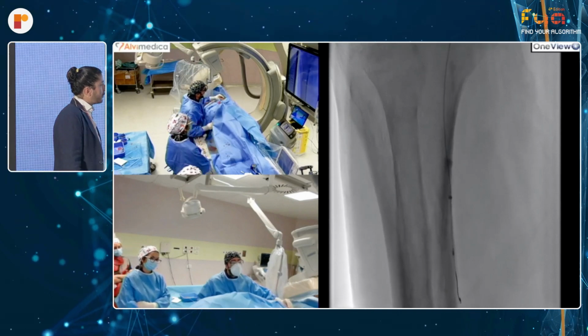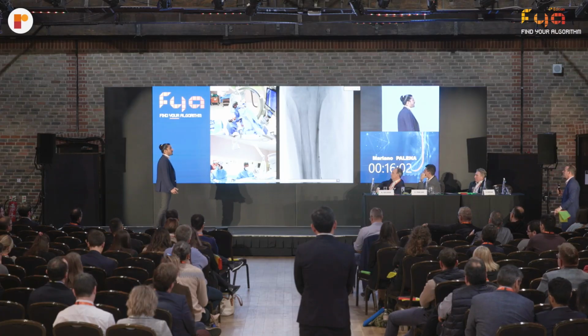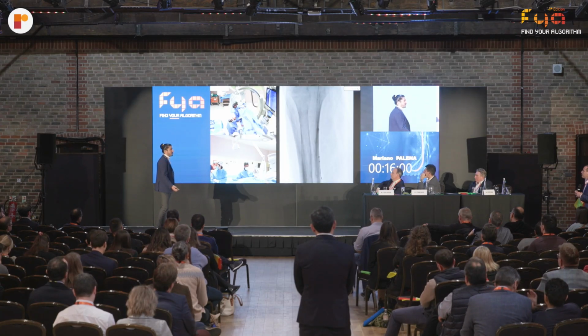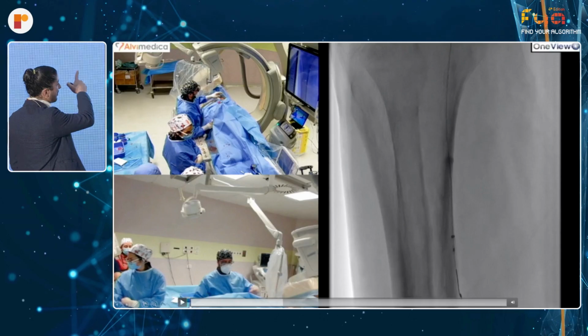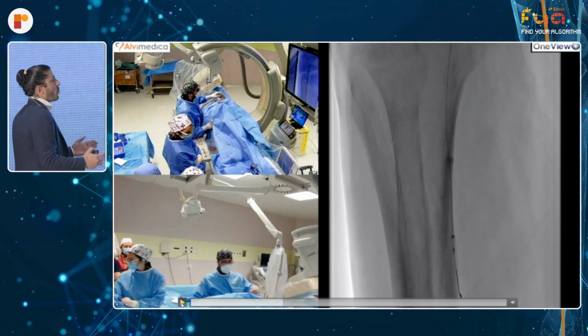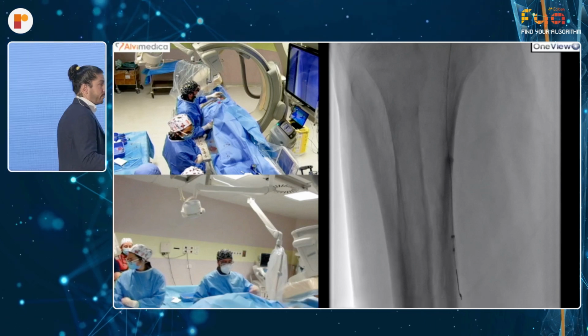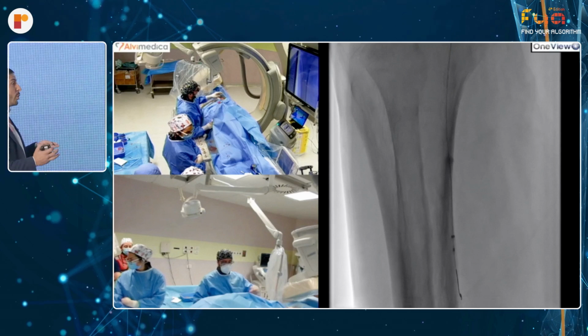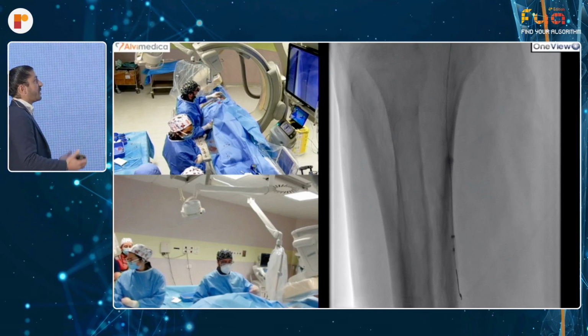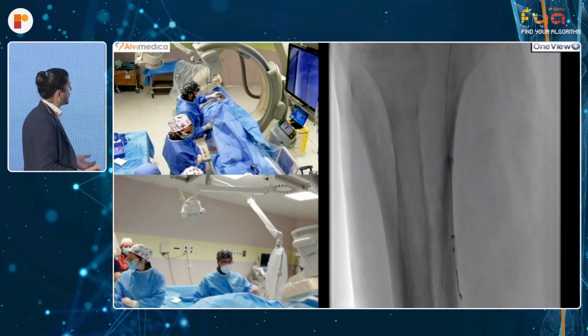Just share with us why you're going for the posterior tibial when it was the peroneal. Because I suspect a new anatomical variation. So I was able to see the arch finishing directly in the first toe, and this is a quite typical situation in which you don't have dorsalis pedis. So not a hypoplastic dorsalis pedis, but absent. 11% of the population doesn't have dorsalis pedis.